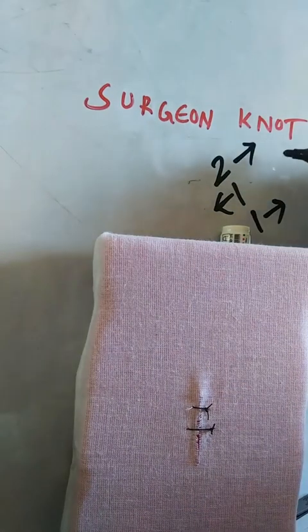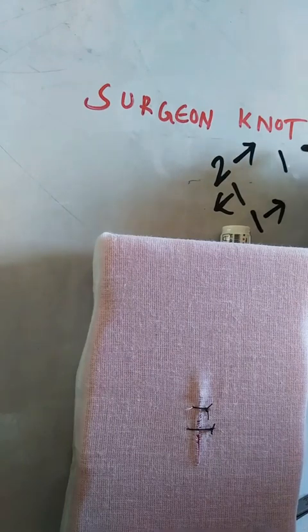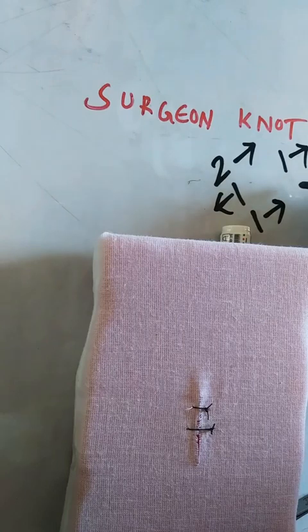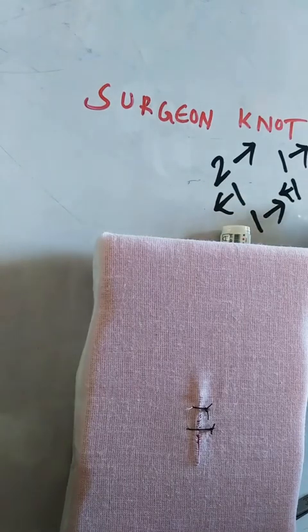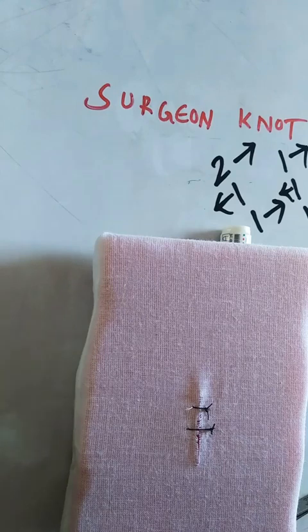So in the square knot, the first tie is of 1 throw in clockwise direction, the second tie is also of 1 throw in anti-clockwise direction, and the third tie is again 1 throw in clockwise direction like this. So this is about the surgeon's knot and square knot.